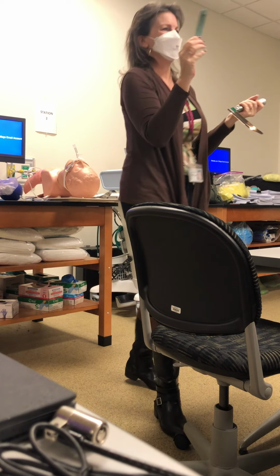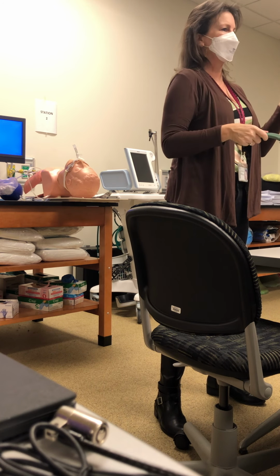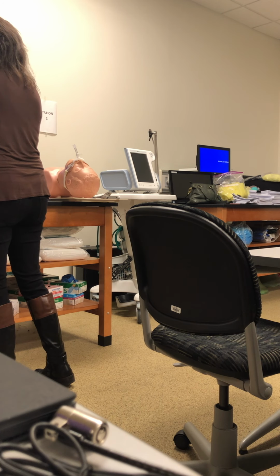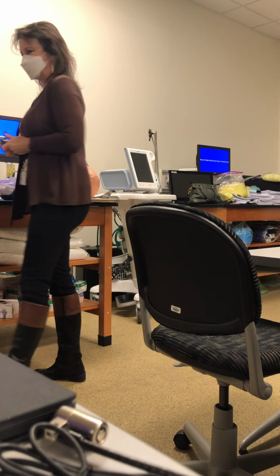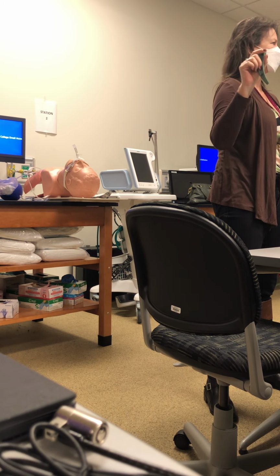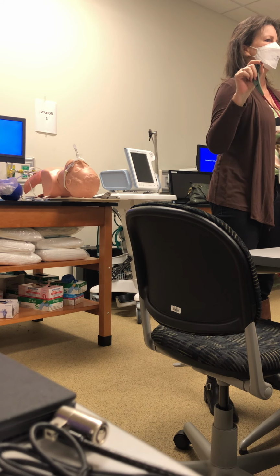This curved blade is called a Macintosh. The straight blade is called a Miller. So write that down. Straight blade is Miller. Curved blade is Macintosh. You said curved blade is what? Curved blade is Macintosh. It's in your PowerPoint. Macintosh, and the straight blade is a Miller. Okay?